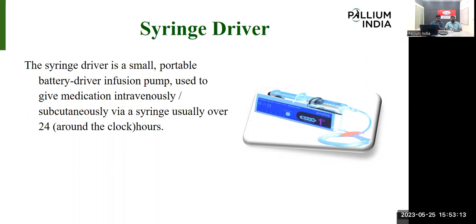But with this syringe driver, the patient can carry it in a carry bag and continue every activity.